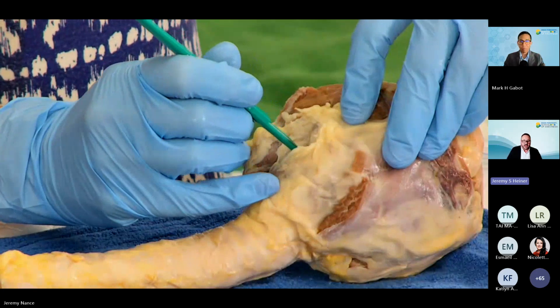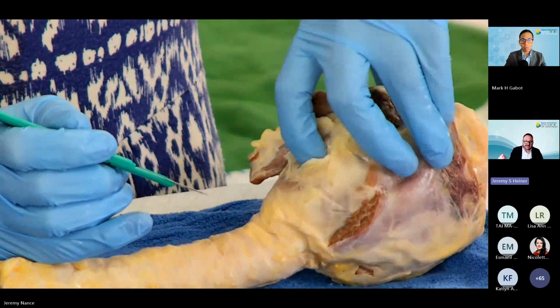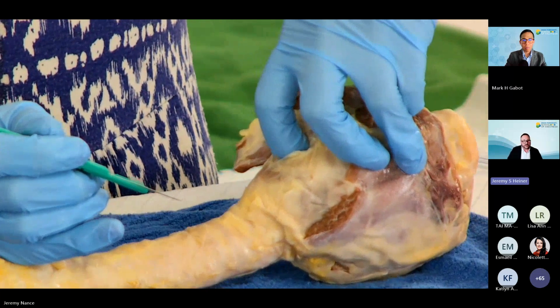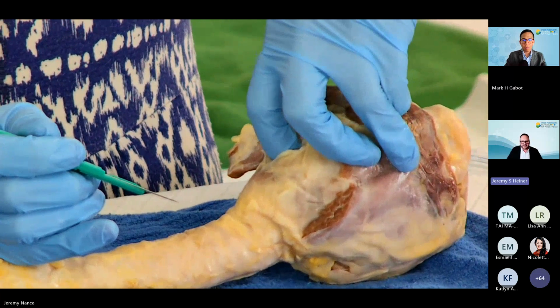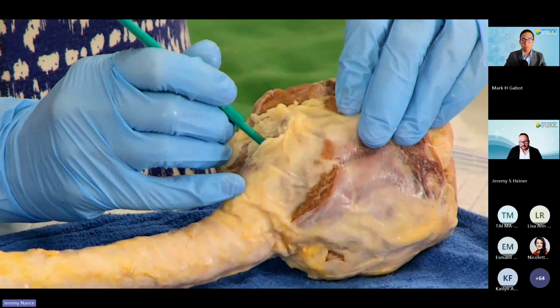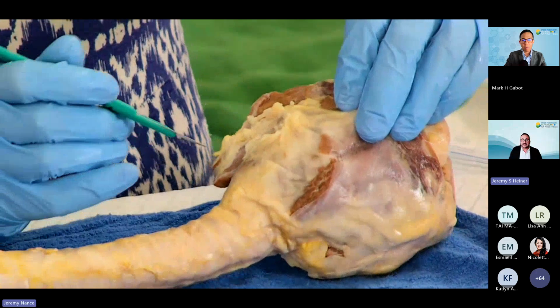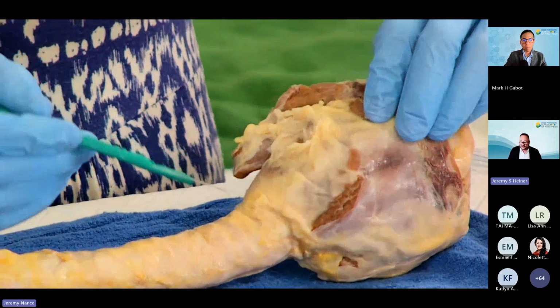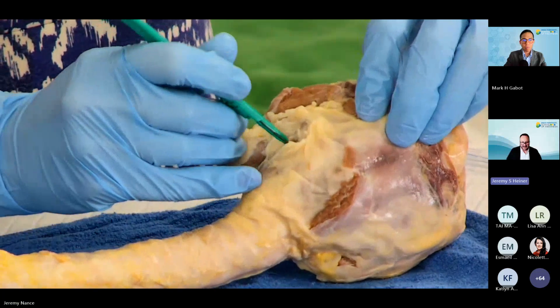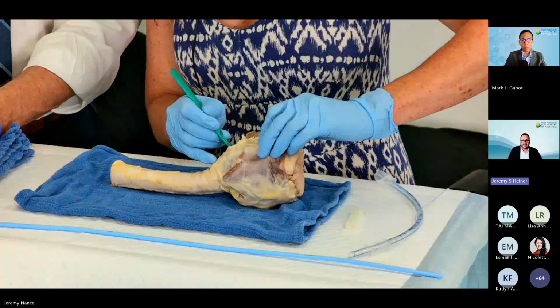Perfect. Now you're going to incise laterally until you meet resistance with the lateral side of the cricoid cartilage. You guys, this is a big incision. It's an emergency. We've got to get a tube in, and we're going to rely on our surgical colleagues. Other lateral side too. Rotate it 180 degrees and then cut all the way to the other side.